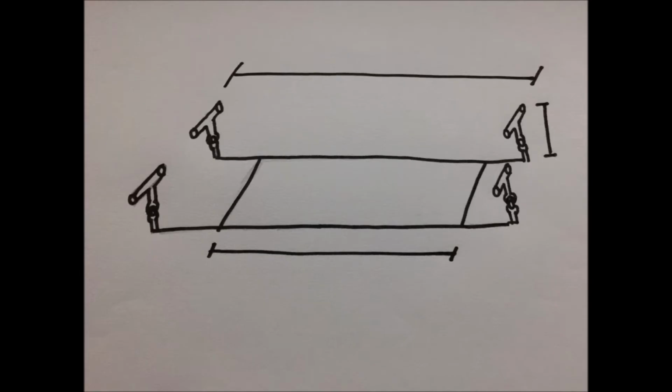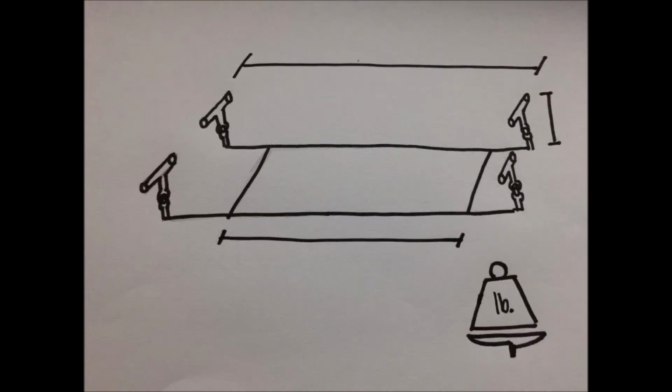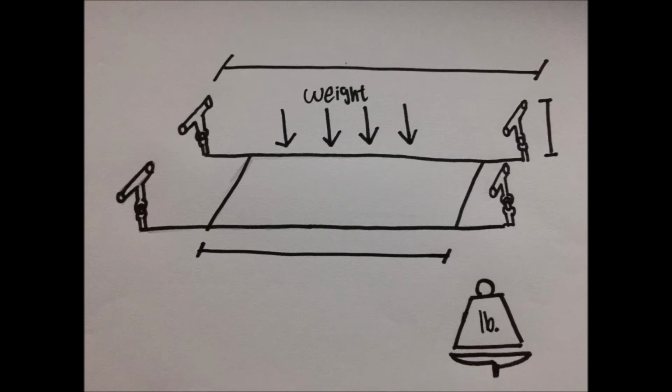Prototyping. After that, the actual prototyping of the product, taking into consideration the dimensions it needs to have. Constructing it to have a weight that will be easy to carry around and use, even with additional handles, will also be taken into consideration to prepare it for the testing, as well as the overall weight it is capable of supporting.